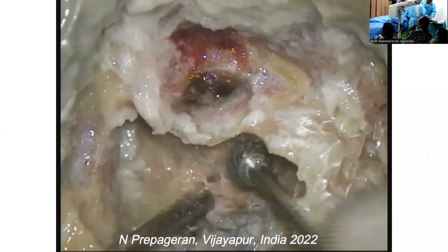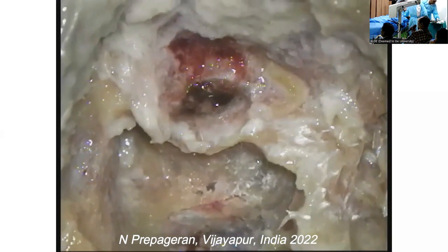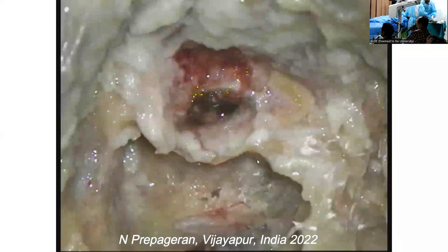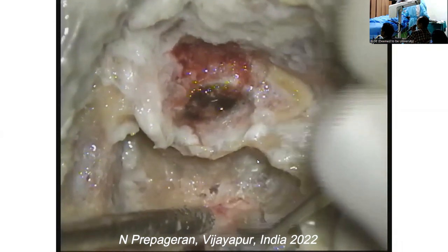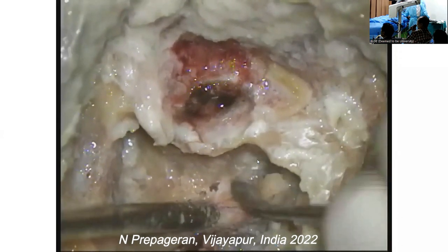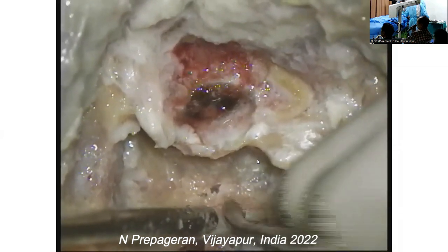So when you're approaching the skull base, the exposure of the endolymphatic sac is mandatory. We have to expose the endolymphatic sac, sir. The kick is too much. Yeah. Now I'm just going to use... that's the endolymphatic sac coming into view. Okay. See what I'm using? I'm using a facial elevator.